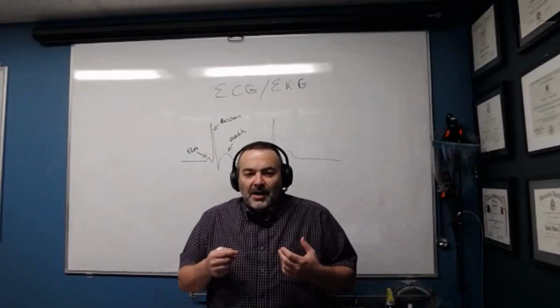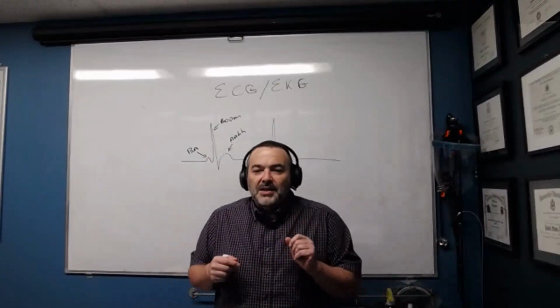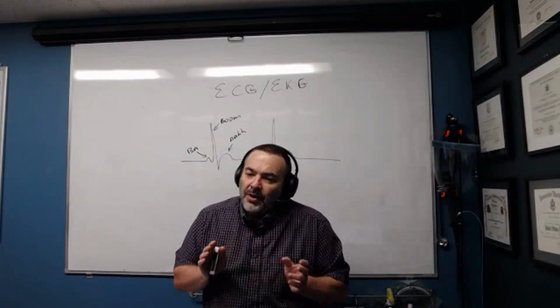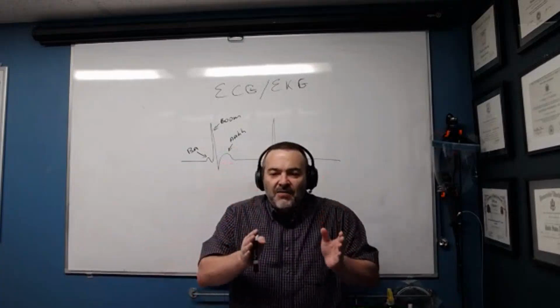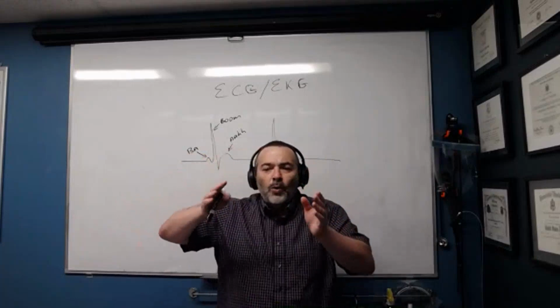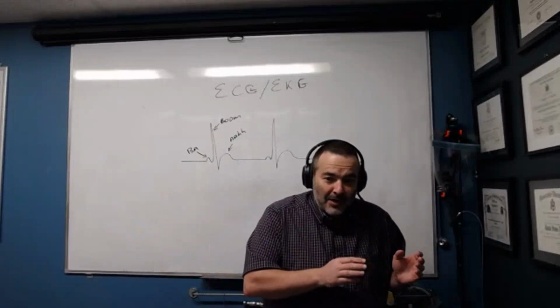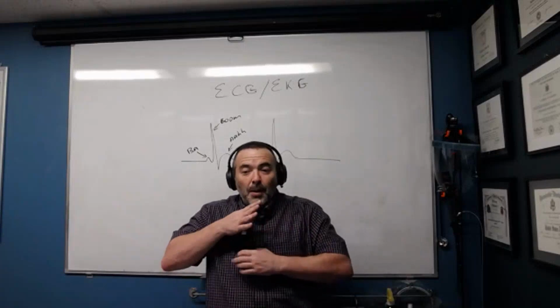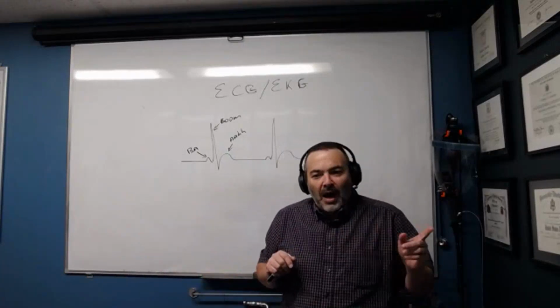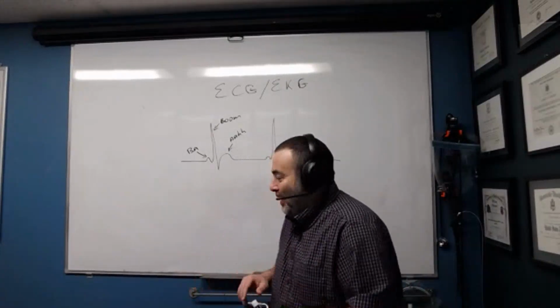Sing it out. Don't be afraid. Put the actual sounds to this. And that's how the normal heartbeat is supposed to sound. Ba boom, ah, break. Every time there's a ba boom, there's an ah, and there's a break, always at the same time, always at the same place. It may be faster, it may be slower, but it's always the ba boom, ah, break. If you understand the ba boom, ah, break, what I'm going to put on the board next is going to be rather interesting.